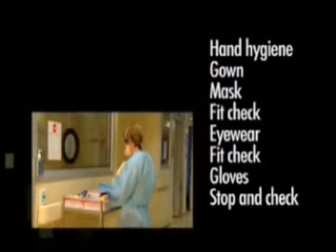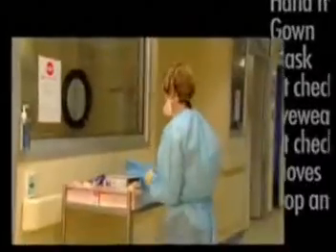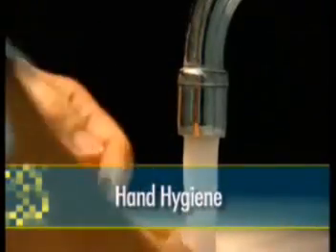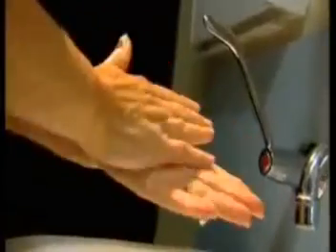Now watch as we demonstrate these steps in detail. Before putting on any personal protective equipment, it is essential that you perform routine hand hygiene. This is considered to be the most important infection control measure in preventing the spread of infection.